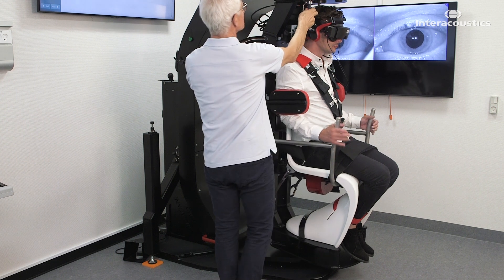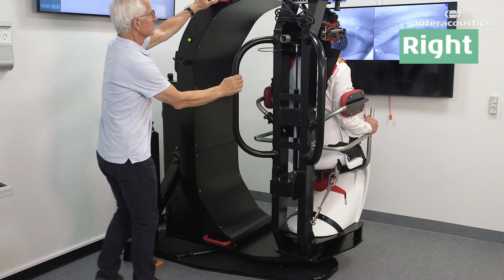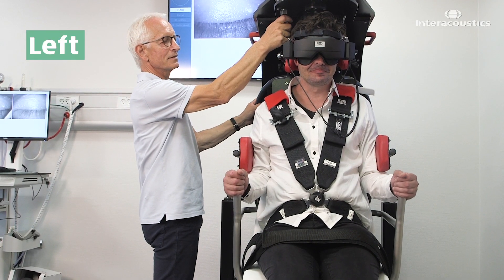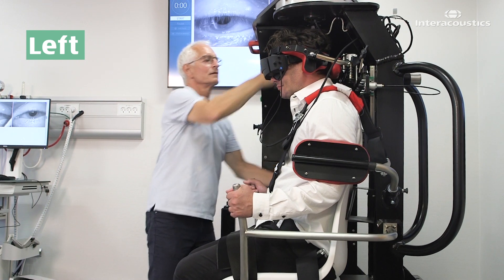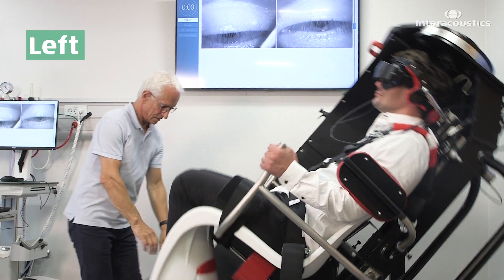To treat right horizontal canal BPPV, turn the patient 90 degrees while in the upright position so that the right ear is pointing away from the chair, then bring the patient into a supine position. If you are treating the left horizontal canal, turn the patient in the opposite direction so that the affected left ear is pointing away from the chair, then bring the patient into a supine position.